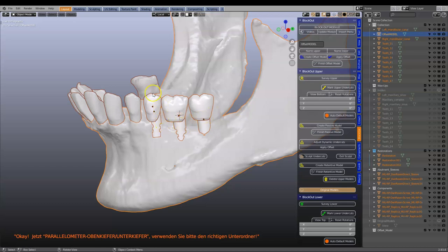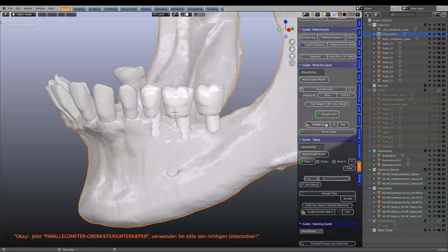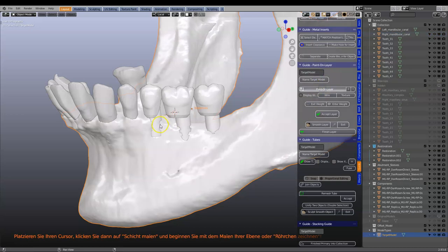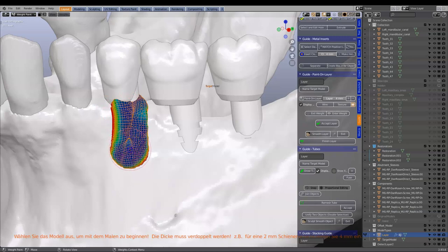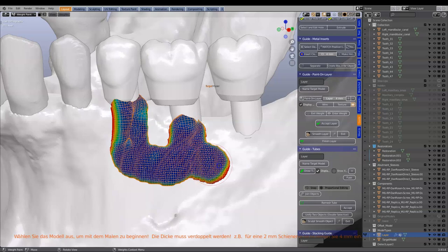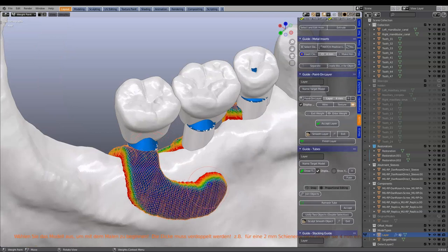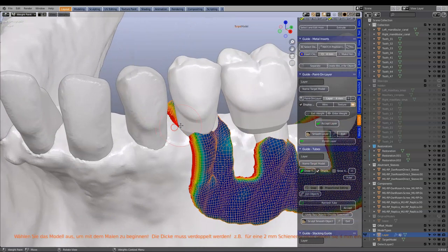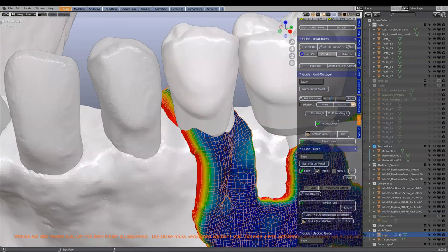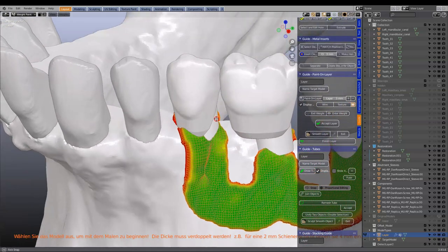Now we're going to paint our layer. I'm going to select my mandible and offset model, and in the guide module we're going to start painting a little layer. This is up to you how you do this layer — I'm not going to advise, I'm not an expert in this. You can do it your own way, whether you want to recess it into the bone or do whatever you want.